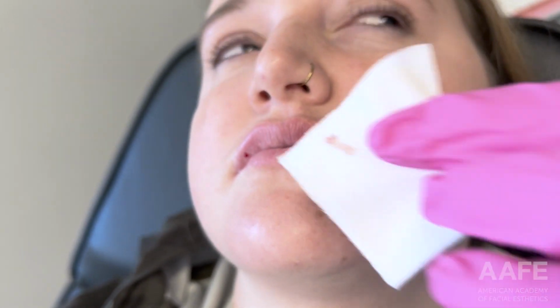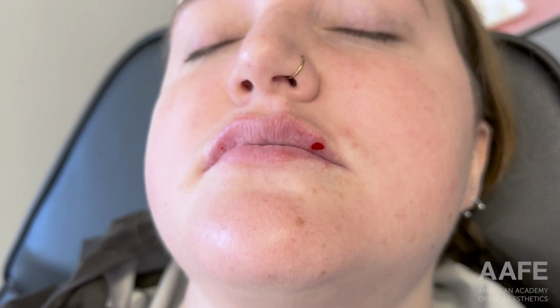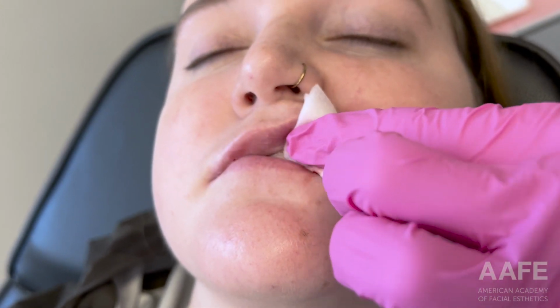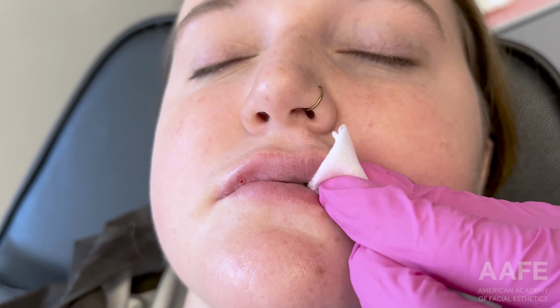Now this is a great patient. She's not bleeding a lot, which of course some of us can't help, but avoiding alcohol, avoiding caffeine, sometimes taking arnica, not taking any NSAIDs. Look, I'm going to jinx us, but not too much bleeding at all. This is completely normal. Avoiding NSAIDs and things like that can definitely help with bruising and swelling.